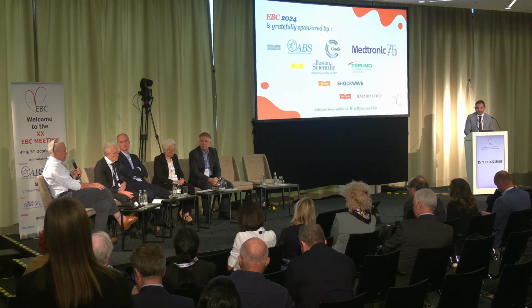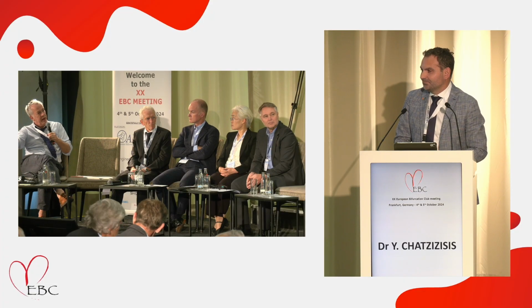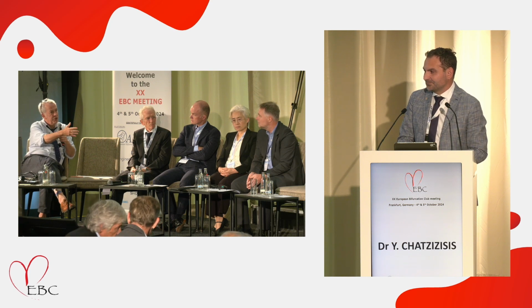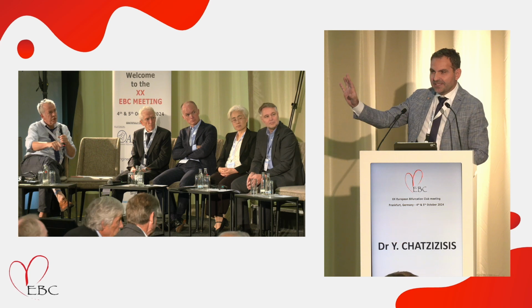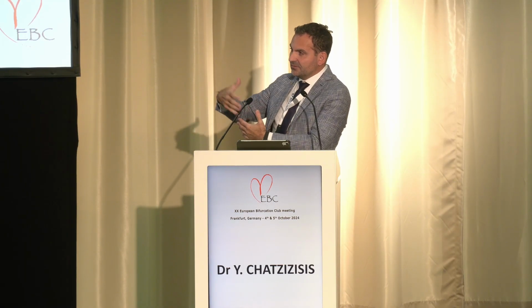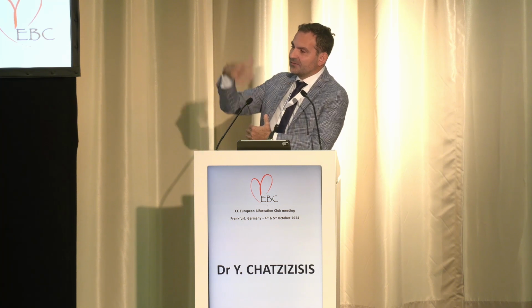Great, lovely computations. I'm not sure I quite understood how you do it though. Presumably this isn't available to you as you do the procedure. You take the images, then take them for computational analysis, work out what you think the artery will respond to, and then the patient comes back for the treatment? What I show you today is two sessions. One is the baseline acquisition of the IVUS or OCT and angiography, and then simulation, digital twin, and planning, and then the second session is the actual delivery of therapy.